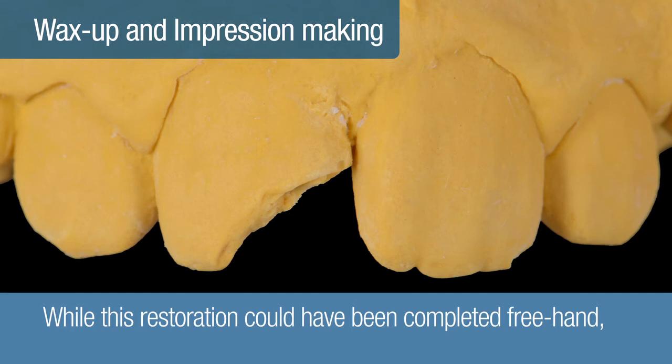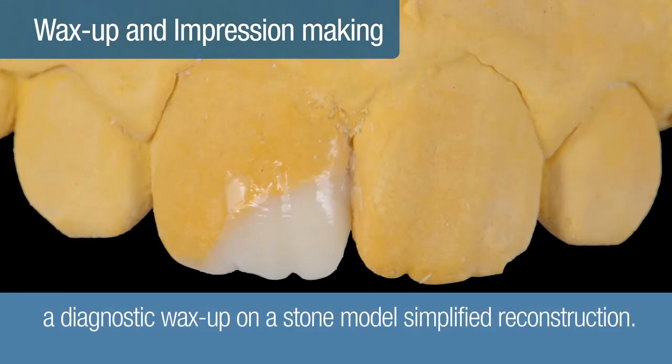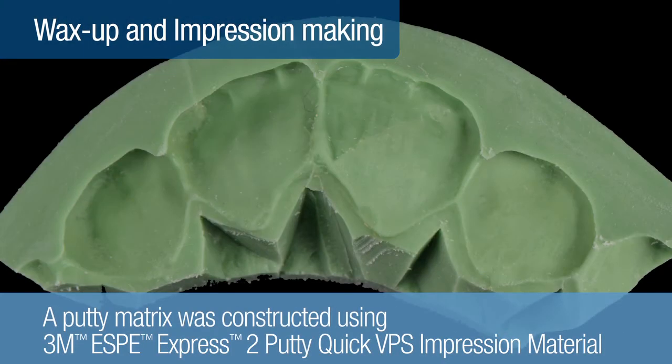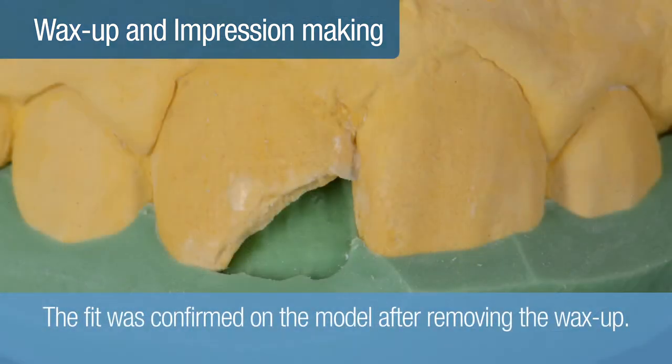While this restoration could have been completed freehand, a diagnostic wax-up on a stone model greatly simplified reconstruction to the desired anatomic form. A putty matrix was constructed using 3M Sil-Tech Express 2 Putty Quick VPS impression material and carefully trimmed to the apex of the incisal edge. The fit was then confirmed on the model after removing the wax-up.